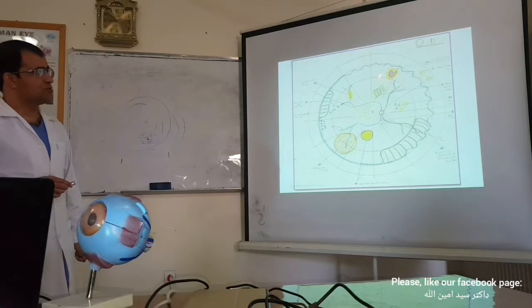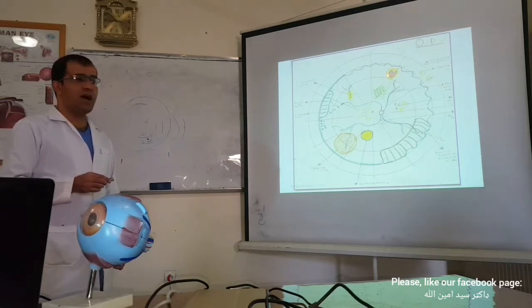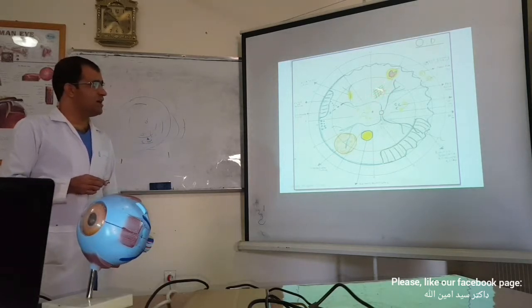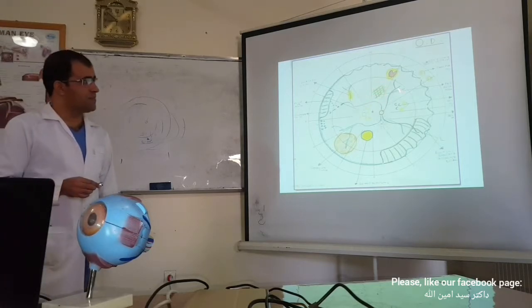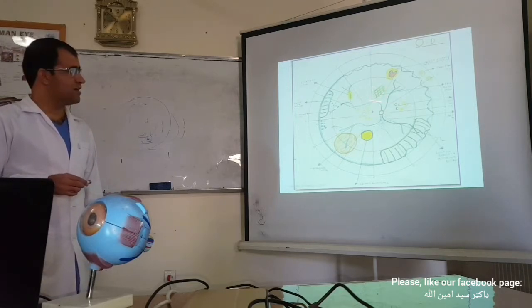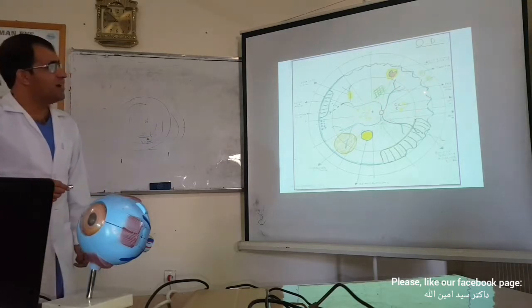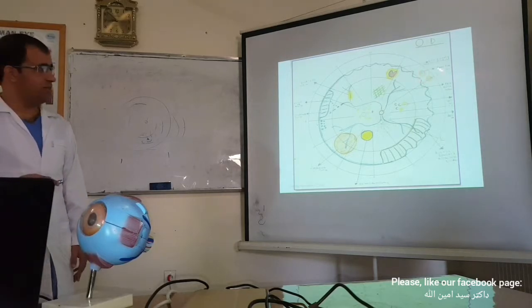And what else? This is going to be the horseshoe tear, and this yellow area is what they call after photocoagulation. Okay, Hamza, what's going to be this one? Degeneration. It's not degeneration, that is in green. That is pre-retinal membrane. You are very interested in macular pucker. That's also going to be in this color. And what are these? These are pars plana cysts. Pars plana cysts are also going to be in brown color.